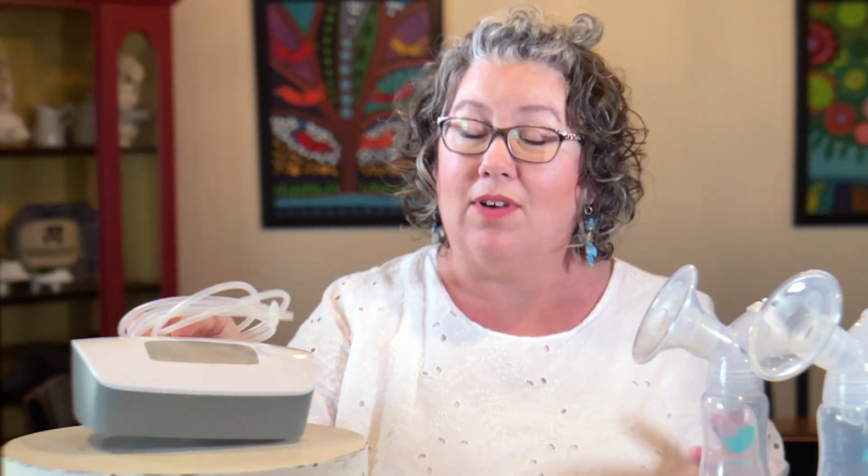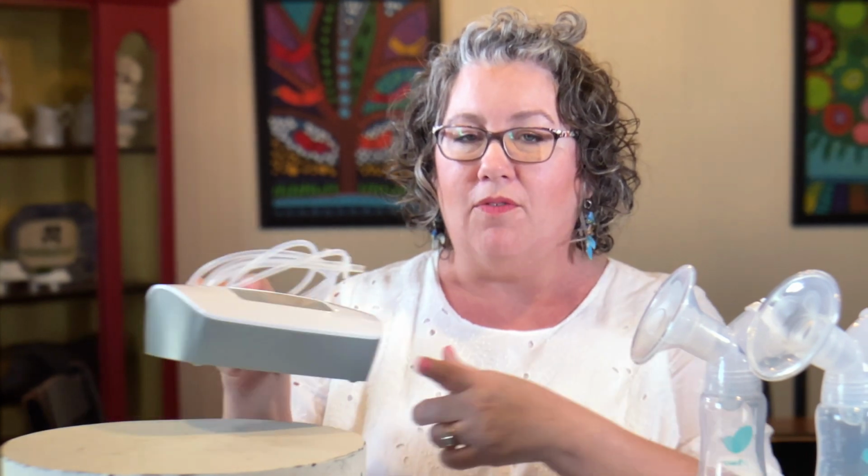Now these parts are never cleaned. They don't ever get wet because they're never going to come in contact with your milk. And for that reason, I'm setting them aside so I can remember not to get them wet or to clean them. All right, let's turn our attention to the pump.